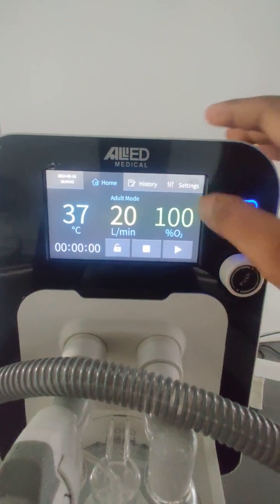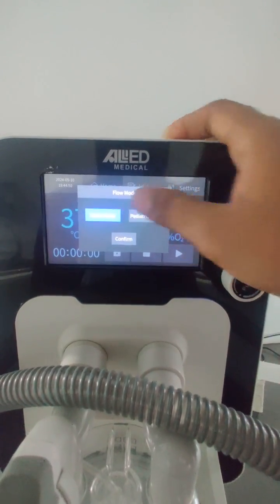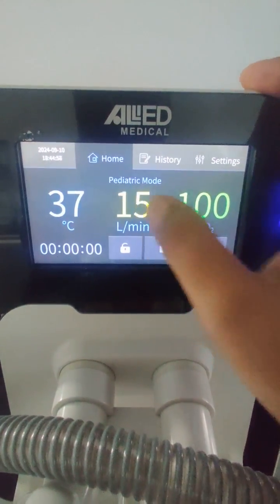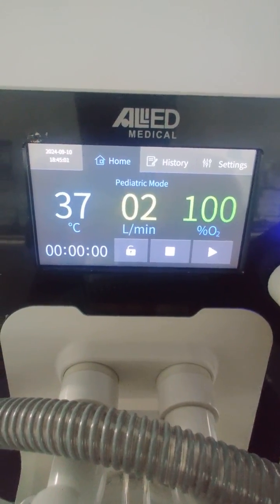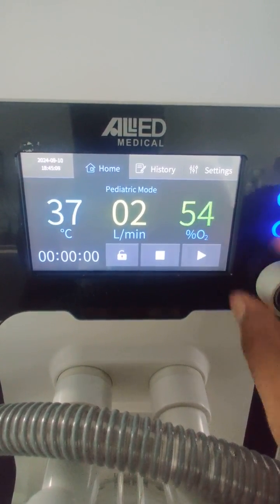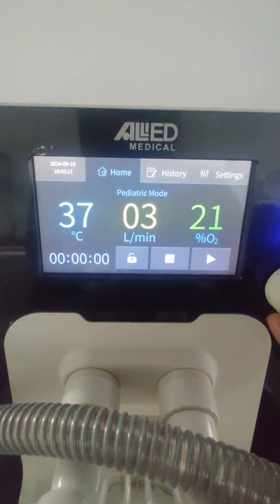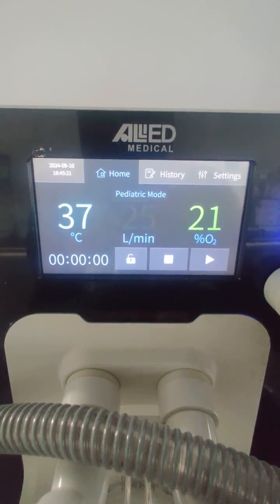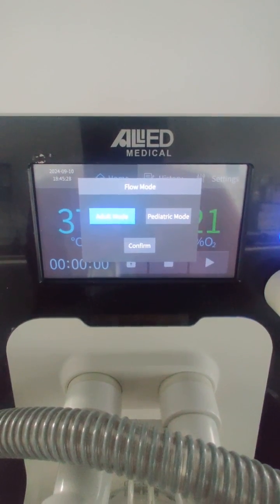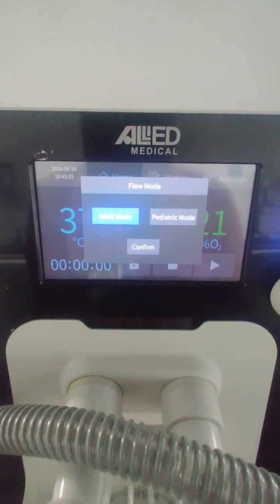To enter pediatric mode, press and hold the adult mode button on the touchscreen — you'll get the option to toggle between adult and pediatric mode. In pediatric mode, the minimum flow rate is 2 liters per minute, with oxygen settable from 21% to 100%, and flow up to a maximum of 25 liters per minute. To return to adult mode, press and hold again and select adult mode.